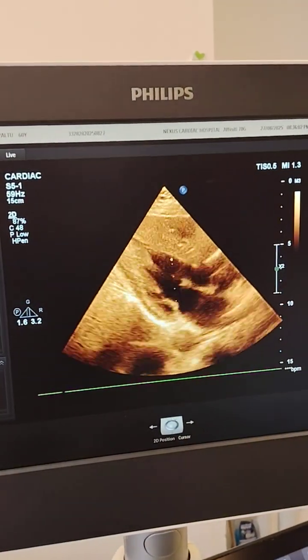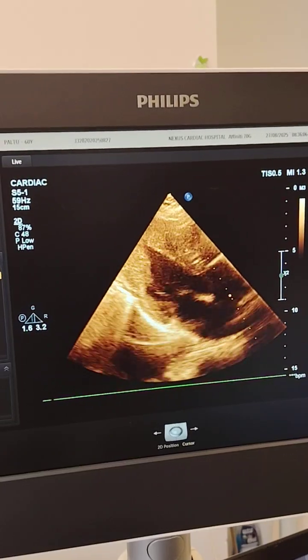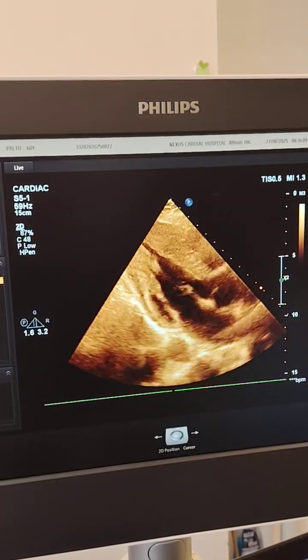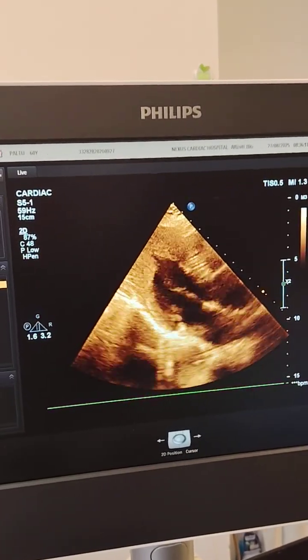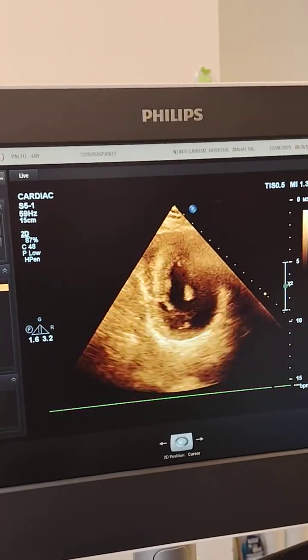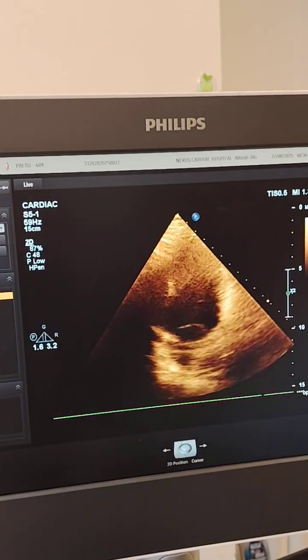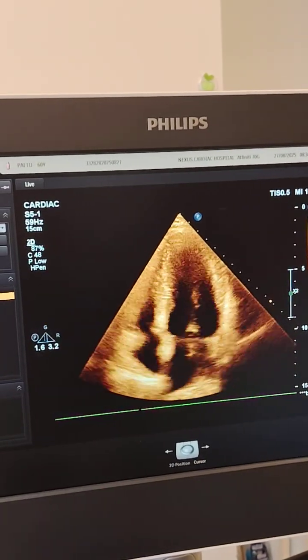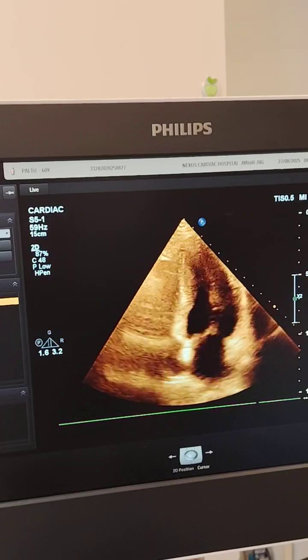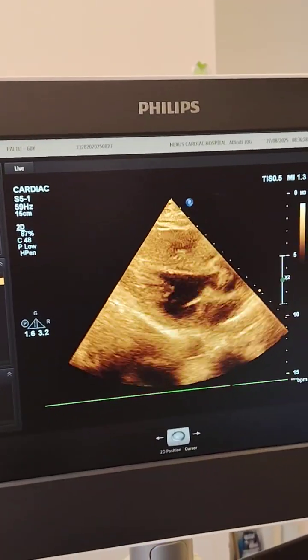It may be hypertrophic cardiomyopathy, a genetic autosomal dominant variant, or it may be an infiltrative cardiac disease, sarcoidosis or amyloidosis, something like that. So we can confirm by CMR or GLS. So this is the 2D evaluation of the echo.